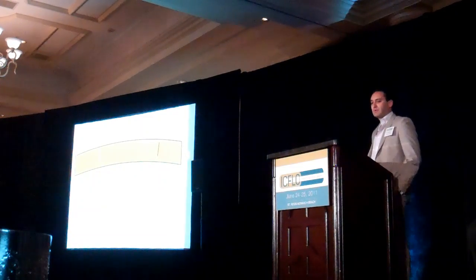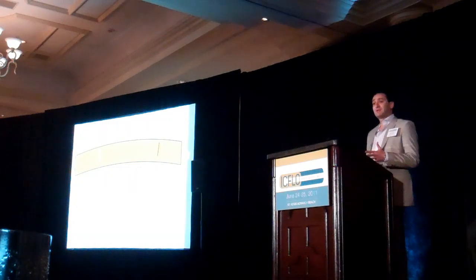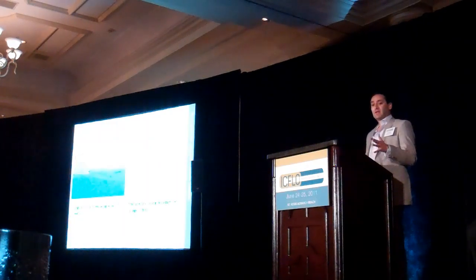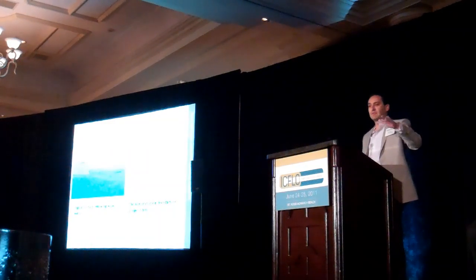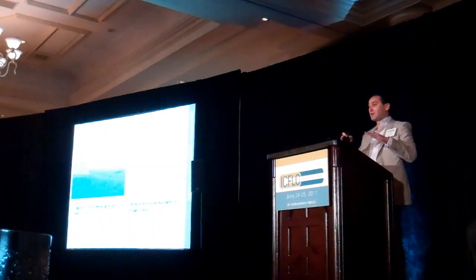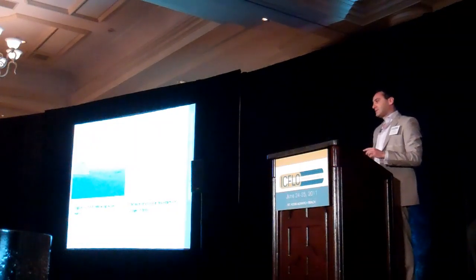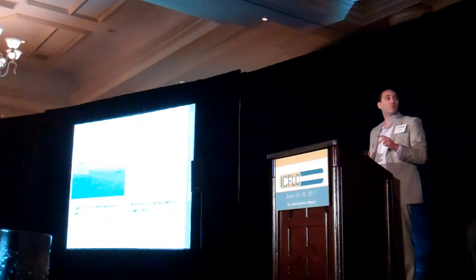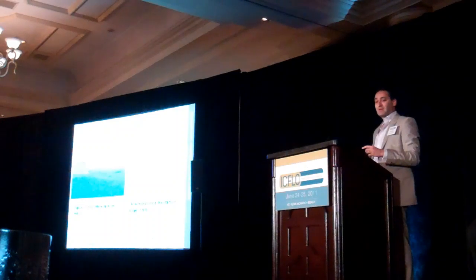of tissue response. So sub-Bowman's incision, well, it may affect wound healing. Why? It throws out our current idea of epithelial damage and that cascade of wound healing. And on several levels. One, that cascade is different, but two, there's no more surface irregularity, epithelial hyperplasia at these breaks where the incision is formed. And you could argue that maybe the use of femtolaser sub-Bowman's will also result in less disorganized collagen fibrils, which we started off today's session talking about in the morning.